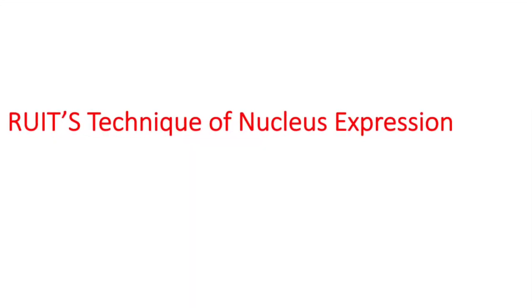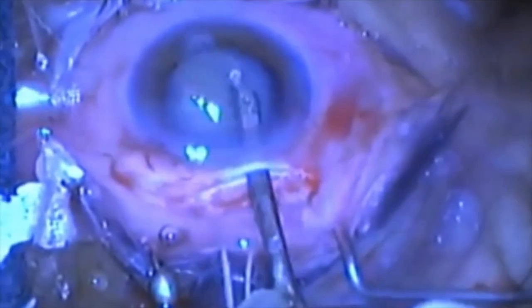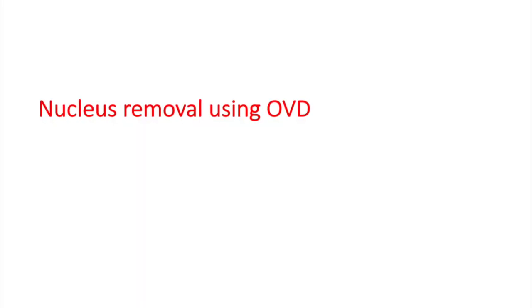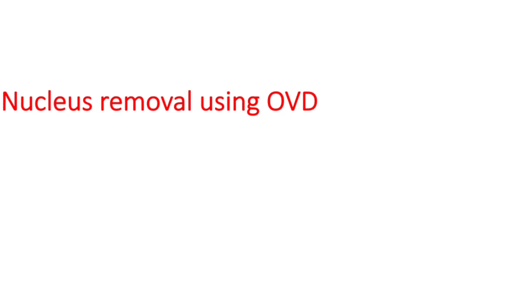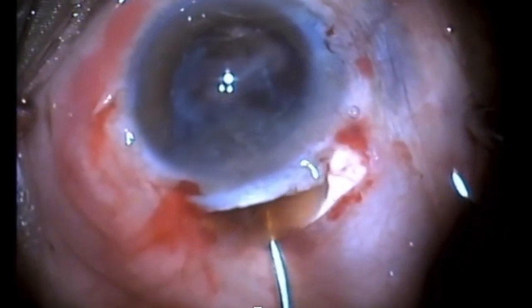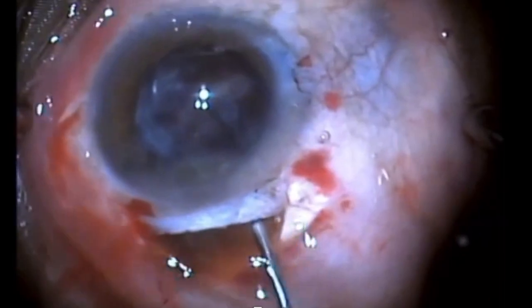This is Dr. Sandhu Kruit's technique, in which after a large rhexis, a Simcoe cannula is used to prolapse and remove the nucleus from the anterior chamber. Many surgeons are also using OVD for nucleus expression in manual small incision cataract surgery by creating a positive pressure in the anterior chamber by pushing visco from the side port.